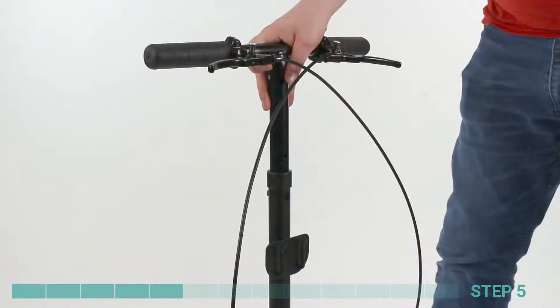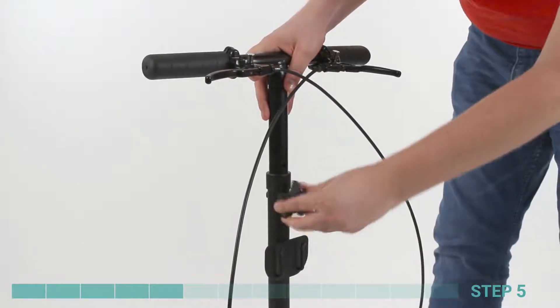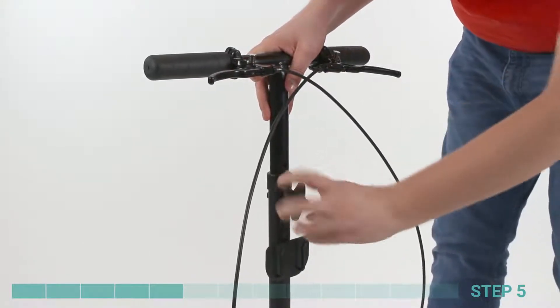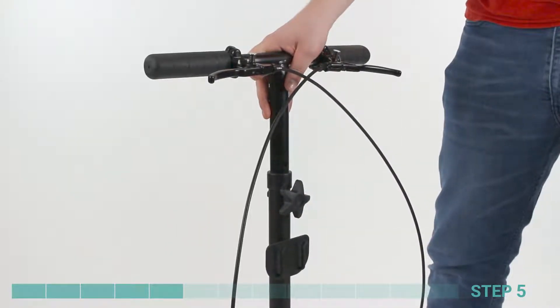Step 5. Adjust the handlebars to your desired height. The hole in the steering column should line up with the desired hole on the handlebar pole. Insert the adjustment knob back into the hole at the top of the steering column and tighten.